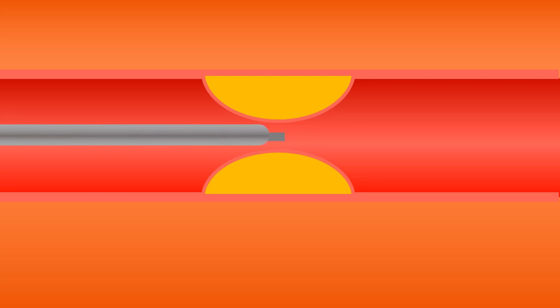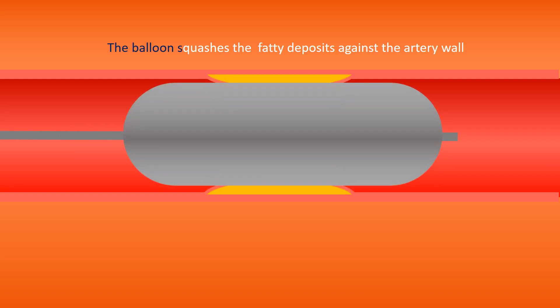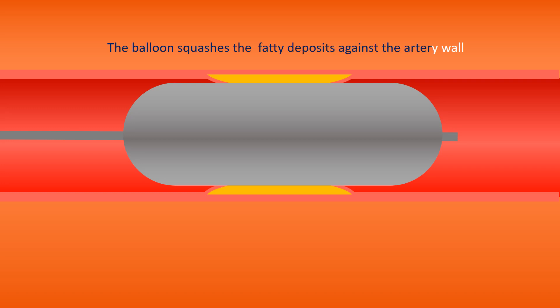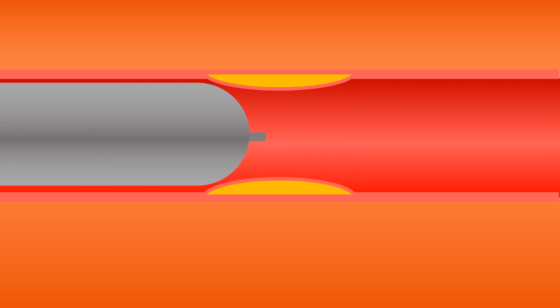When the catheter is in place, a thin wire is guided down the length of the coronary artery, delivering a small balloon to the affected section of the artery. The balloon is then inflated to widen the artery, squashing fatty deposits against the artery wall, thereby enlarging the lumen, and after the deflated balloon is removed. This allows the blood to flow through the artery more freely.